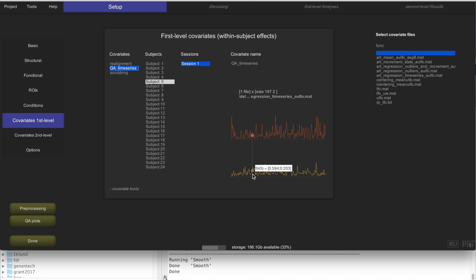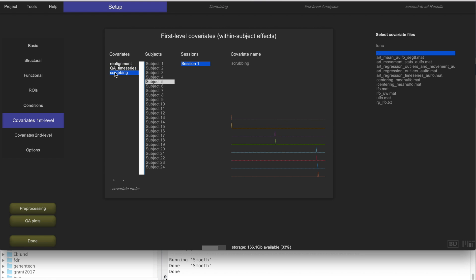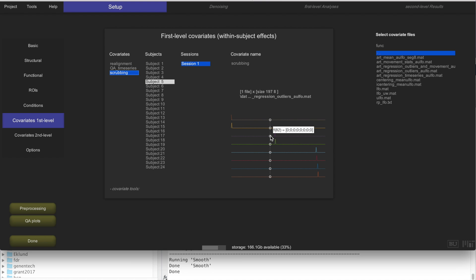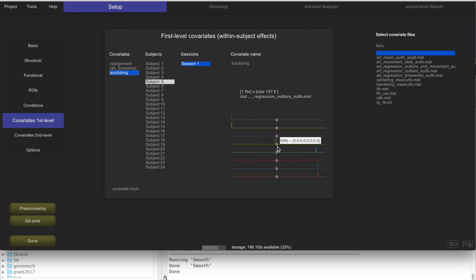The second time series is framewise displacement — a measure of how much the subject moves from one acquisition to the next. High values represent a lot of motion between two adjacent scans and are a good indication of potential outliers. Scrubbing is the identification of potential outliers in these two time series. This is the result of ART, the outlier identification step — it identifies scans that might be potential outliers because of too much motion or too many global signal changes.